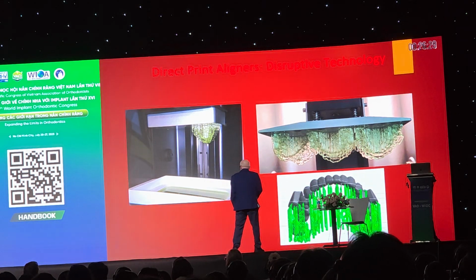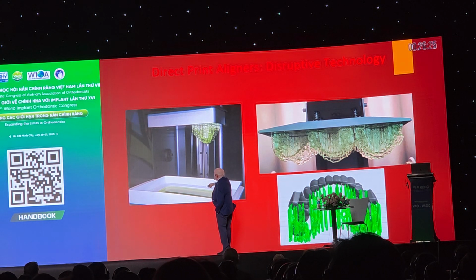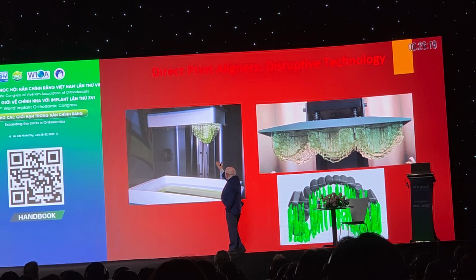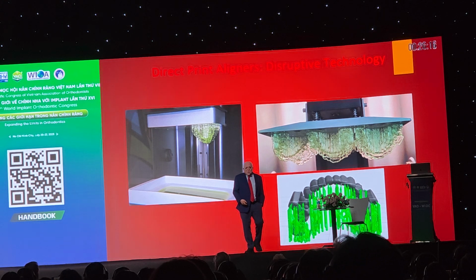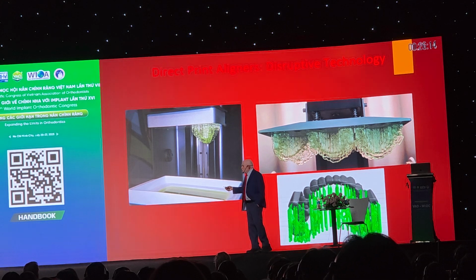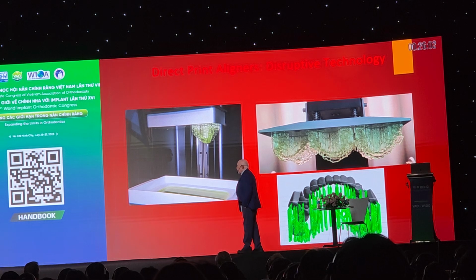So what are we basically doing? We are putting a resin in a tray in the 3D, and this plate is going to come in, and we are going to have this lighting, and then you will see within about 30 minutes you're going to have aligners ready. They'll be yellowish. They go through the centrifuge to take all the resin out, and then polymerization, 5 minutes with oxygen taken out, 20 minutes with nitrogen. Done.